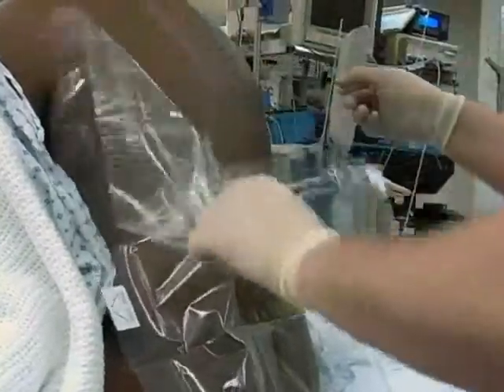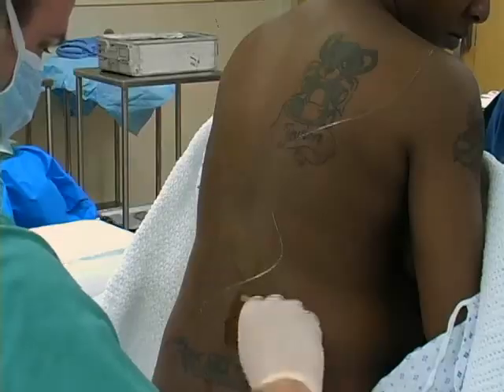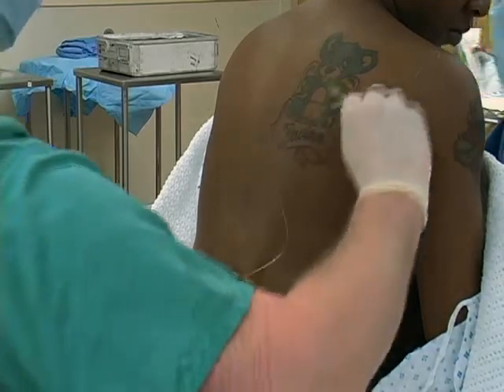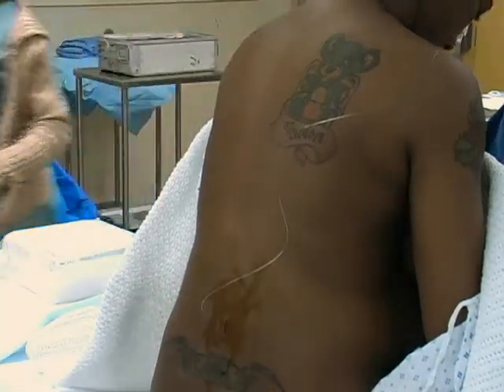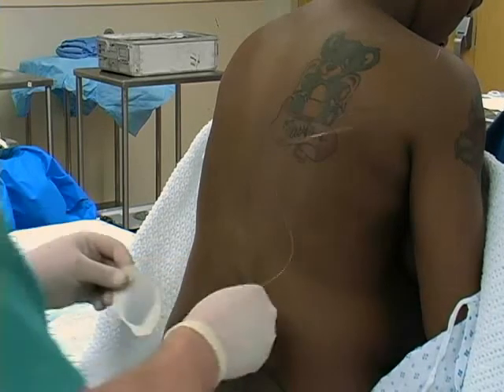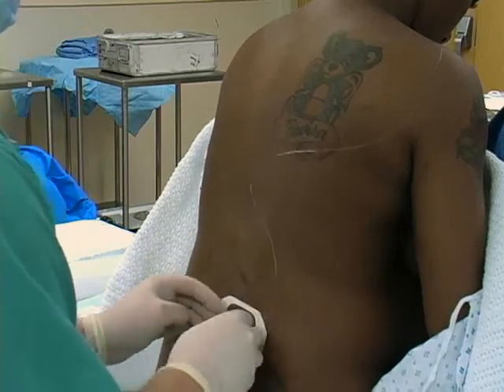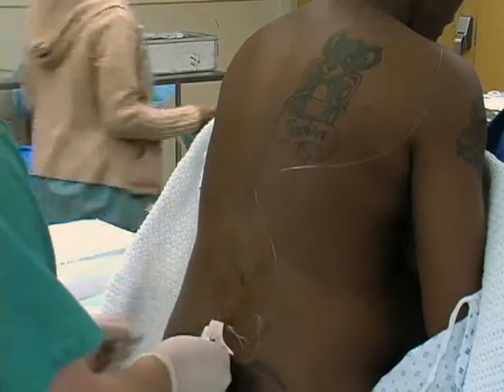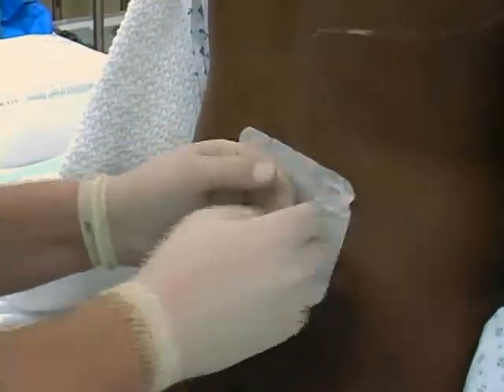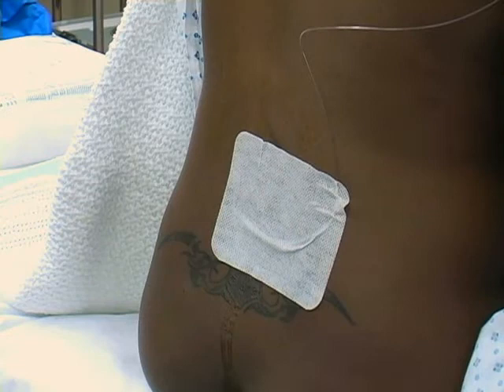Remove the sterile drape. Apply benzoin to the back in a small area surrounding the insertion site and over the posterior shoulder. Loop the catheter and place it on the benzoin. Place a tegaderm over the insertion site. Using Metapore tape, cover the perimeter of the tegaderm to keep the epidural site clean and dry. Place a label on the epidural catheter.